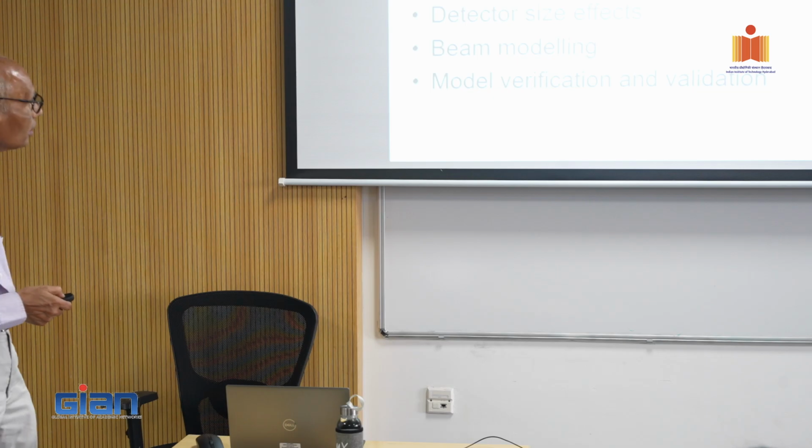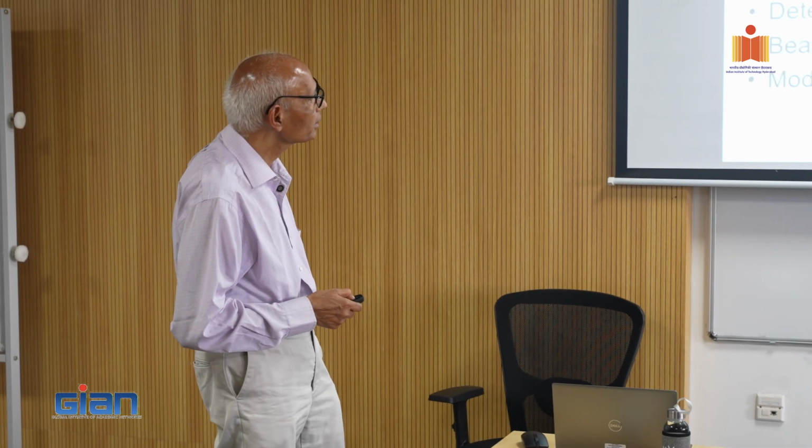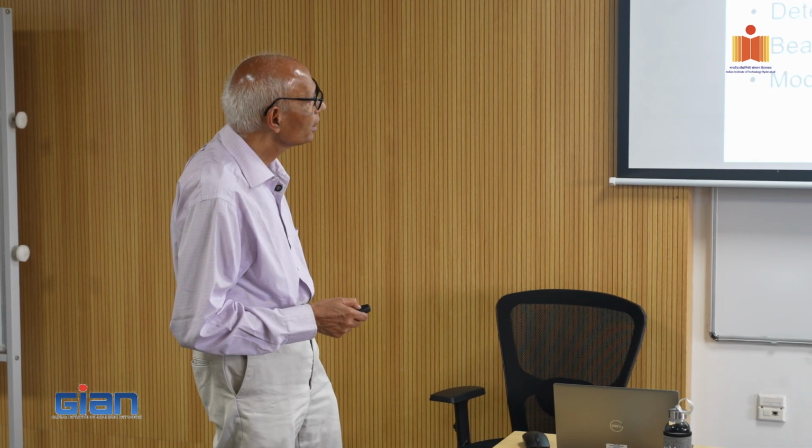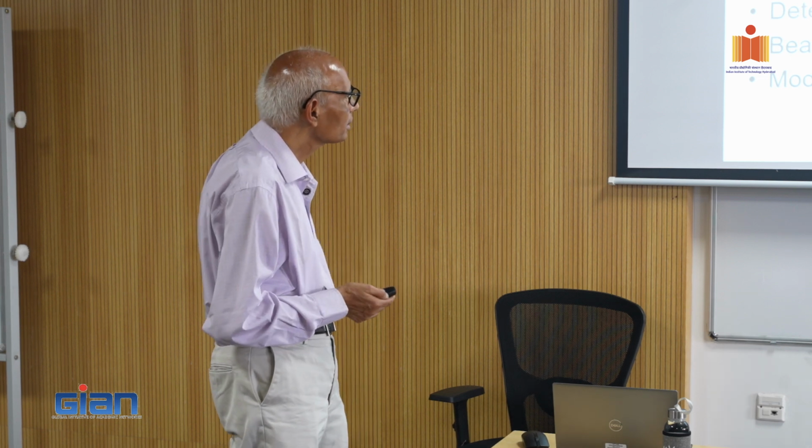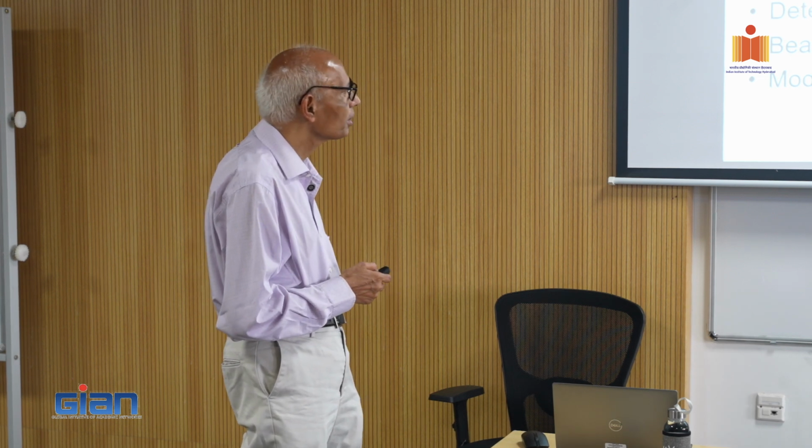So you have to know what your treatment planning system is. It is not an easy process; every system has some advantages, certain disadvantages. You have to choose whatever is the best, and then get that system, and understand the treatment planning system. And one of the things you do first is look at what data you need to configure the treatment planning system.